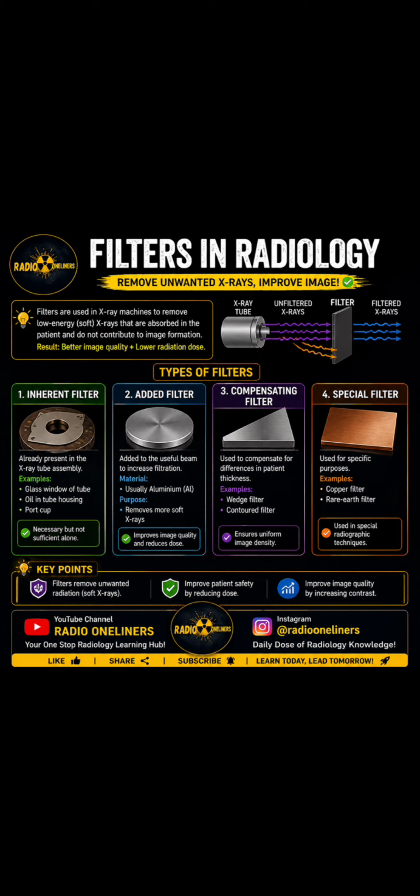In this video, I'm going to talk you through how filters in radiology help us to improve our images, reduce radiation dose, and ultimately ensure patient safety. So let's start with the basics: what exactly is a filter in radiology?